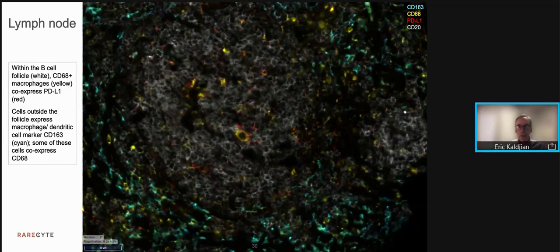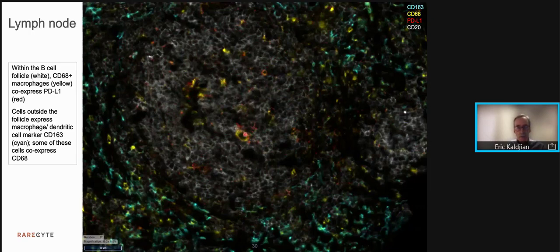Finally, within the lymph node, we have macrophage subsets. Within a follicle, you can see these dispersed CD68 positive macrophages in yellow. Many of these cells are expressing PDL1, the checkpoint marker and target of various drugs, shown in red. And CD163, an M2 macrophage marker, is prominent in the extrafollicular region. Many of these cells also co-express CD68. The background of this follicle in white are the CD20 B cells.